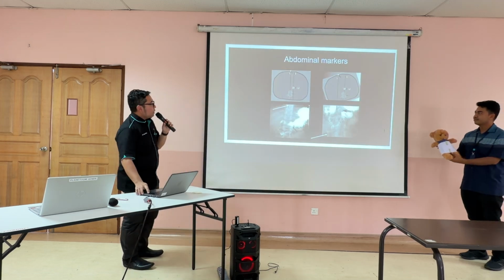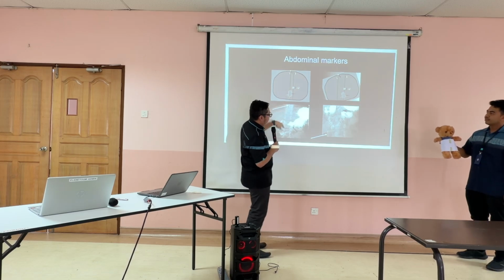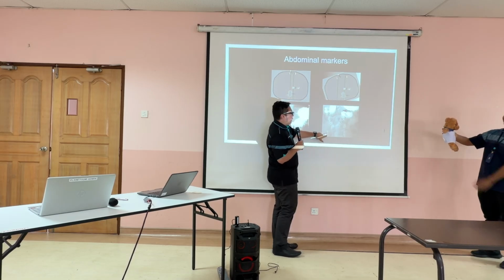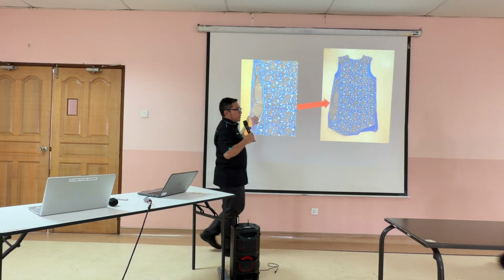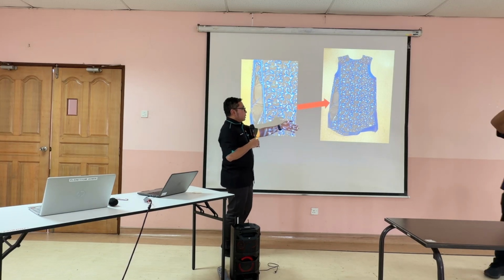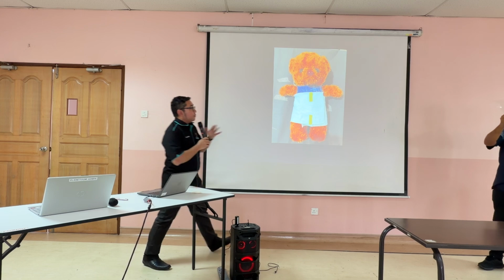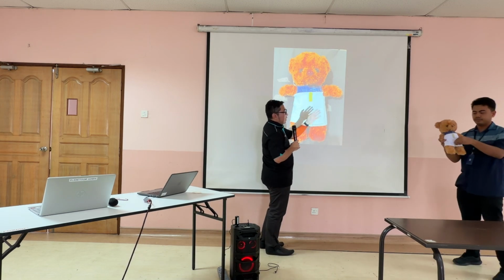So this is the example. When you rotate a bit, you will see the marker is here. What I invented is from the lead gown. This is one lead gown, a tail piece, which we discarded and don't use anymore. So what I did, I cut the lead gown and put the marker at the xiphoid sternum and also the umbilicus to make sure it is at the very center.